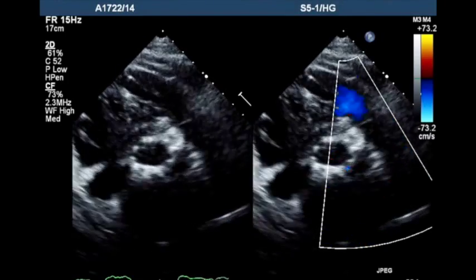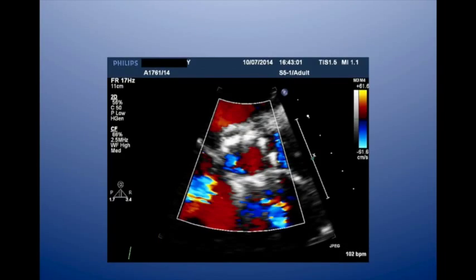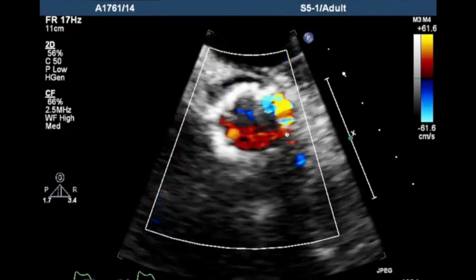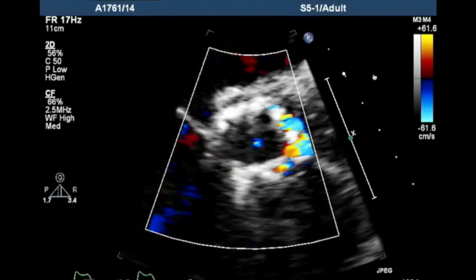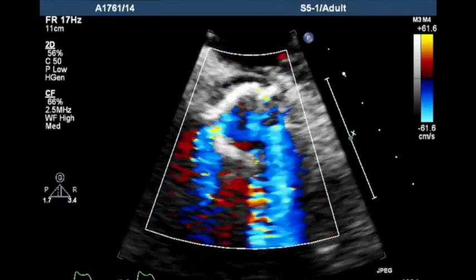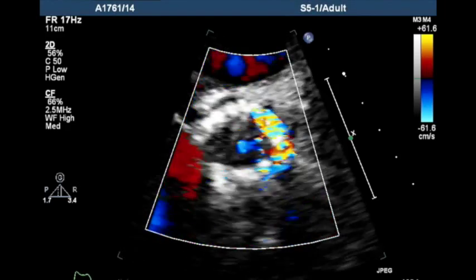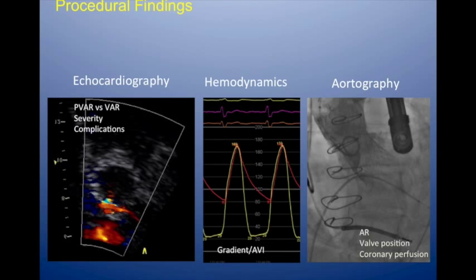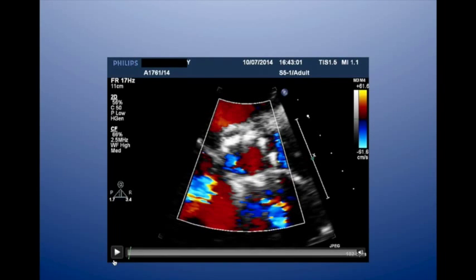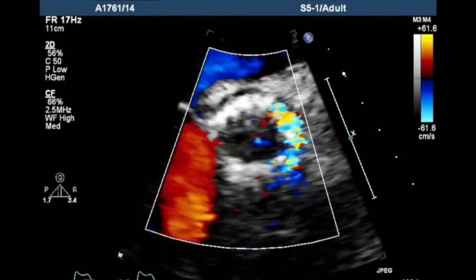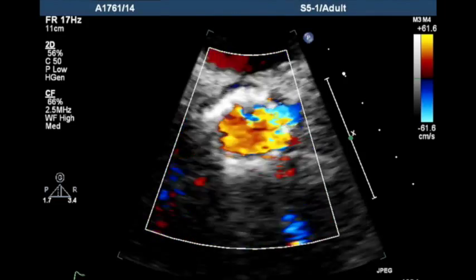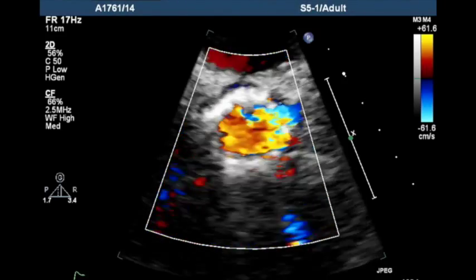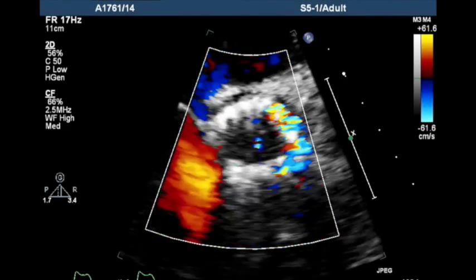Here's a different valve — one we put in two or three weeks ago — with a bit more aortic regurgitation. There was quite a bit more AR; it looks paravalvular, but we really need the echocardiographer to tell us whether it's valvular or paravalvular. You can see this prosthesis is sitting quite deep in the LVOT. In the parasternal short axis on day two, there's quite a bit of aortic regurgitation — certainly more than 10% of the circumference, maybe 20% — so it's at least moderate.